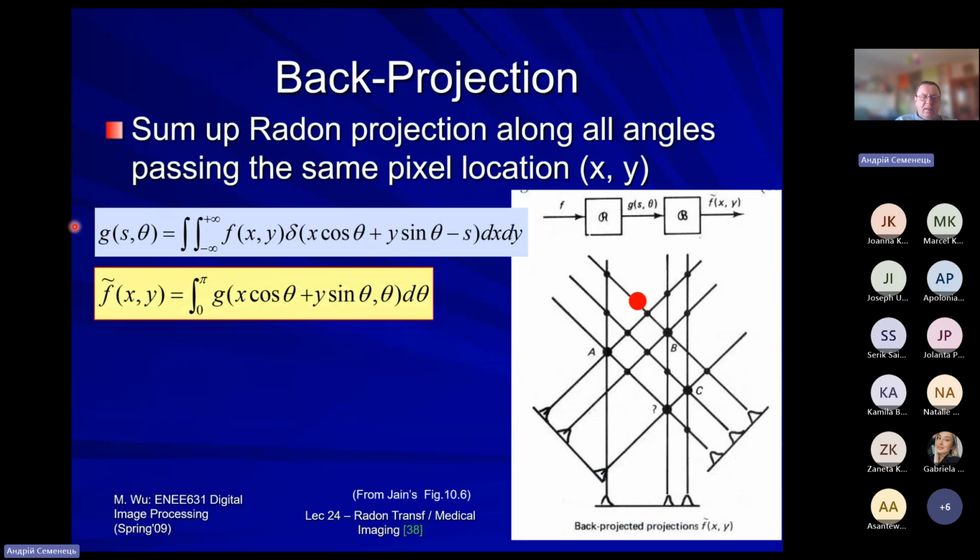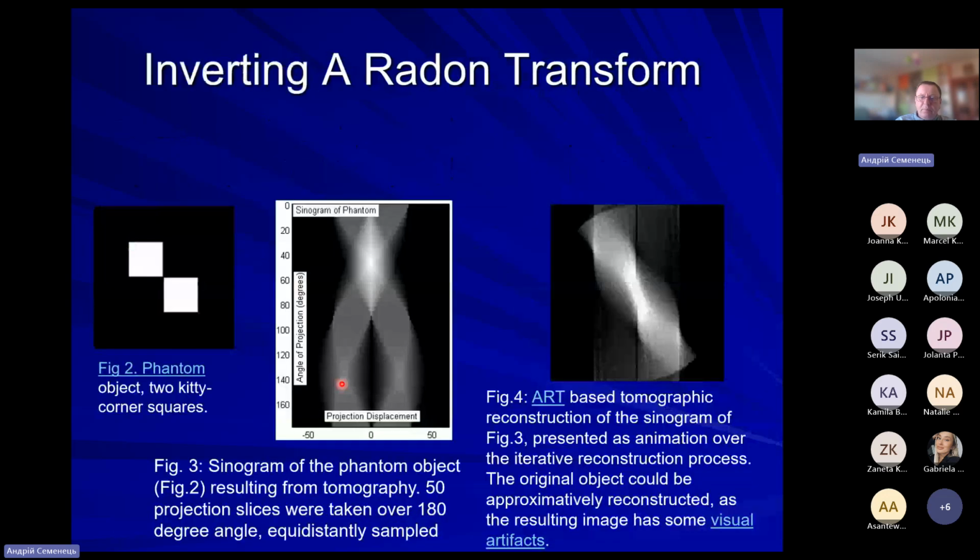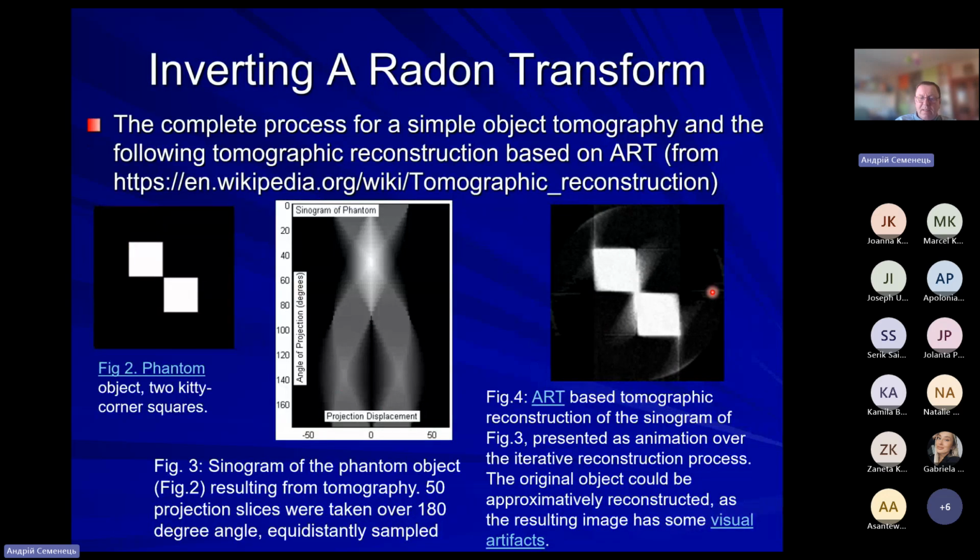And here in yellow, it will be our final result. How can we reconstruct this? There is a projection function, the result of the Radon transformation, and a reconstruction function, the result of the inverted Radon transformation. As you can see, both represent advanced mathematics, and obviously it requires quite significant computation power. But the result will be like this one.